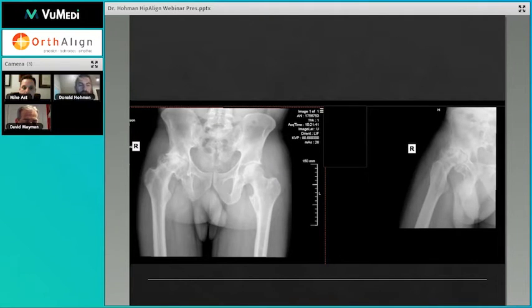In this kind of case, I've also found these to be quite challenging. You know, these kind of cases with these deformities and essentially a fused hip here with sort of a puzzle piece kind of articulation. These require a lot of extensive dissection in order to safely dislocate this hip, but then trying to recreate the acetabular side of this hip is also a challenge. Where do you start? How far do you go? Again, there are no landmarks. It takes a lot of removal of bone just to get into the hip in this kind of setting.